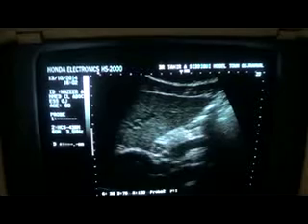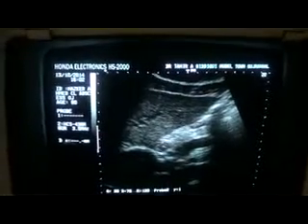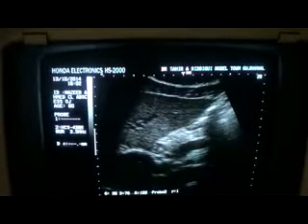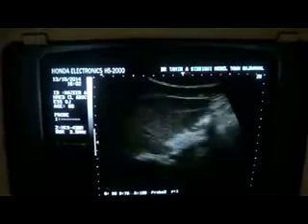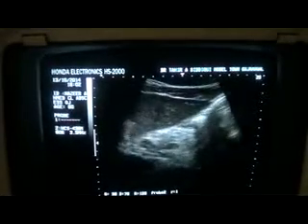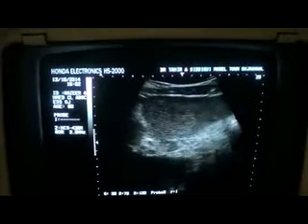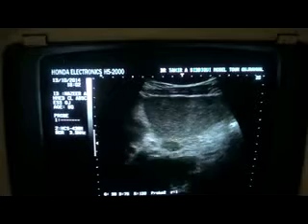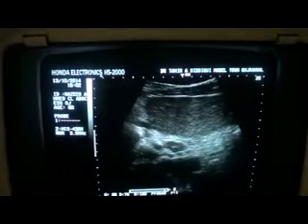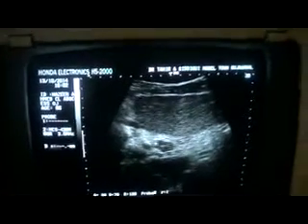This is a small paraceliac enlarged lymph node, small, and this central white dot is represented, suggestive of the fact that it's of benign nature. Aggressive lymph nodes do not show this. Now I have given a sweep to the probe to show you that it has not changed the shape significantly, and here we see this is the lymph node, tiny lymph node.